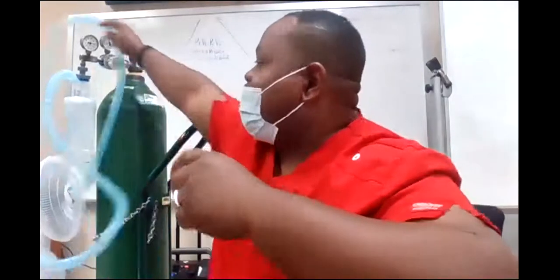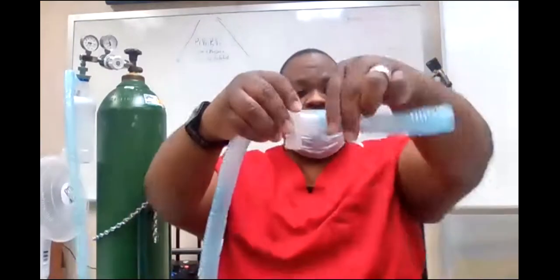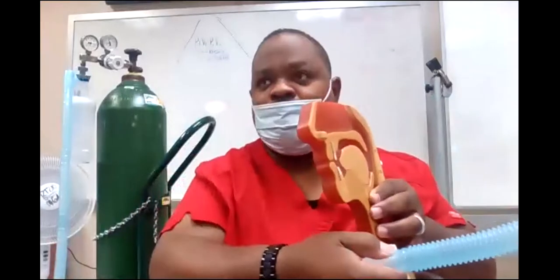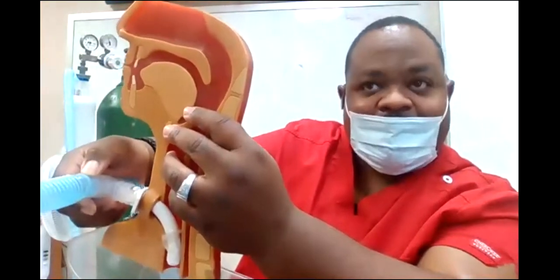So it's simple, same thing, except this time, this end is coming to me. Look right here, this is the end coming to me. I put a T on one end and another one on this end, because I want to fit this one. Some of them don't fit. You've got to find the right one, but I'm not going to worry about it. This is what it looks like. See that? T-piece. Right? Now, what's important about the T-piece, guys, make sure you write this down. When I have an aerosol T-piece, that goes right over my trach. See, it can go over his trach like this. See that? It can fit right over his trach like that, so he's getting his oxygen.